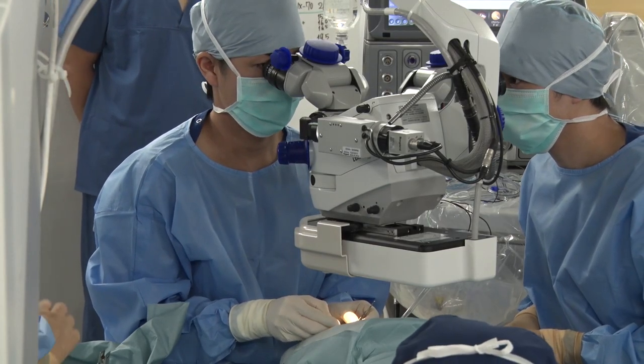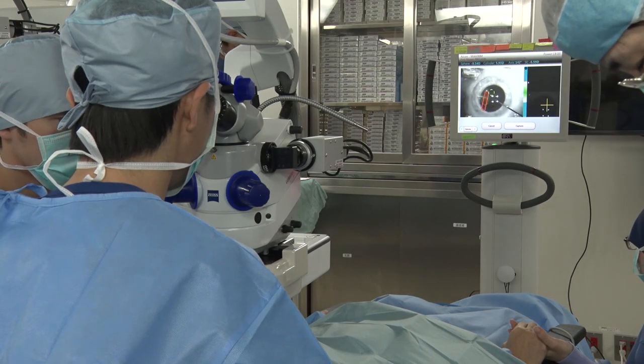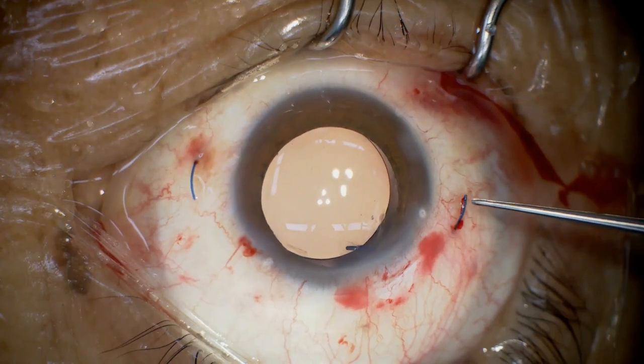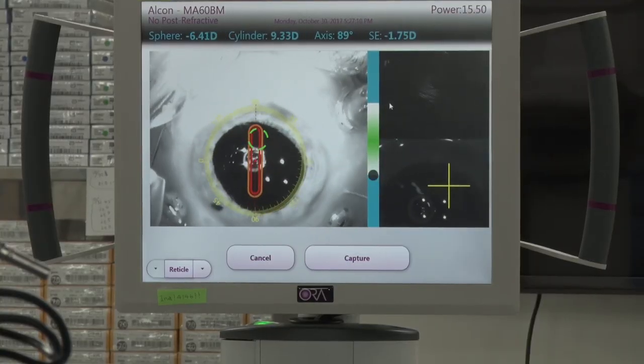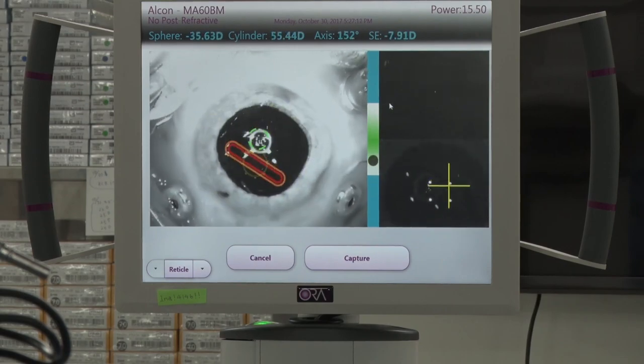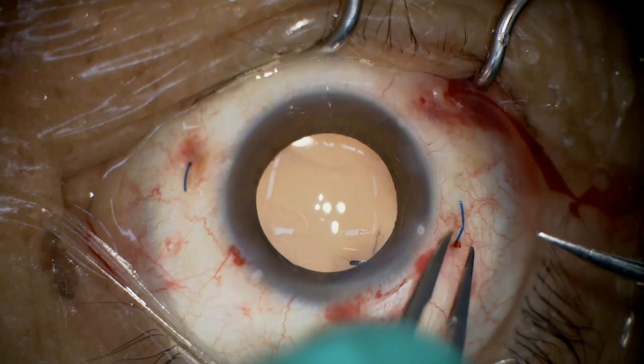We developed a surgical method of adjusting the refraction during surgery. We use an intraoperative wavefront aberrometry to measure the refraction while changing the length of the IOL haptics. We cut off the haptics at a position where the target refraction figure is obtained and fix the IOL.